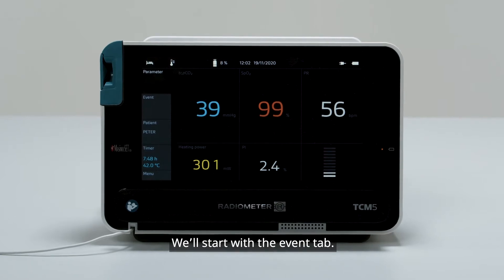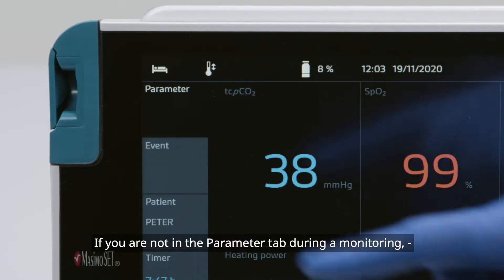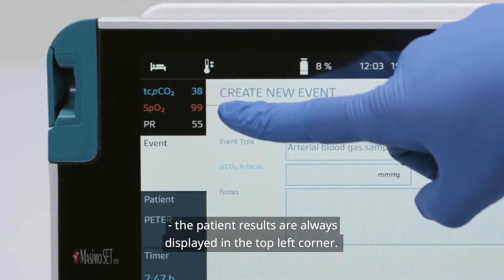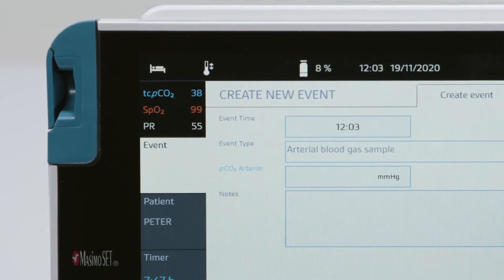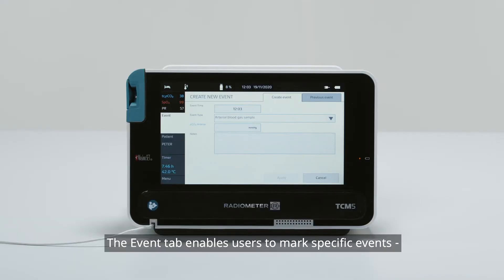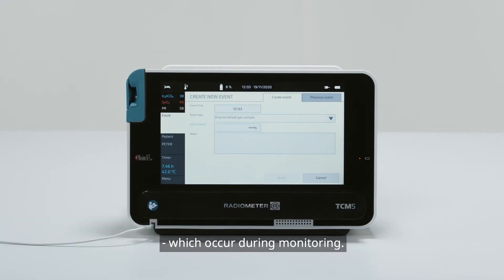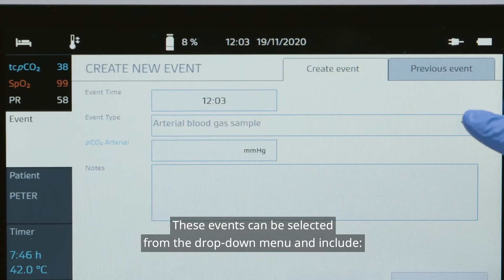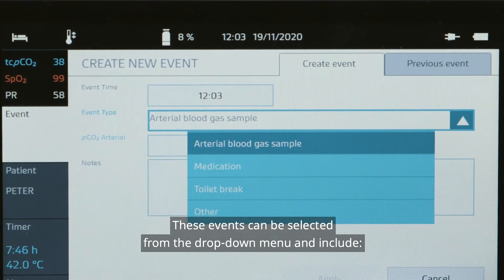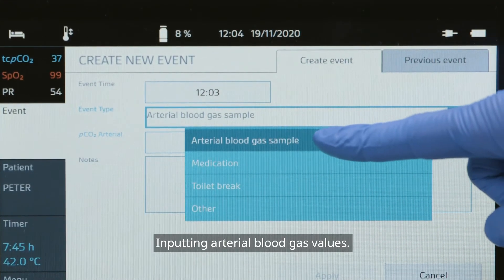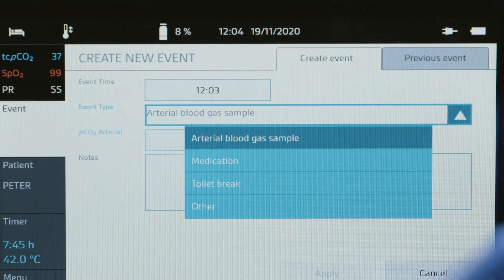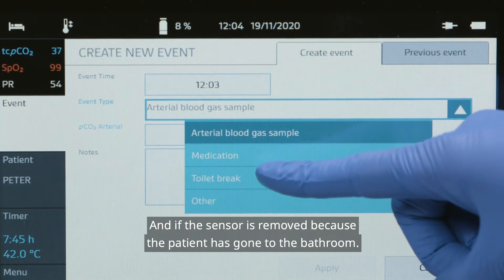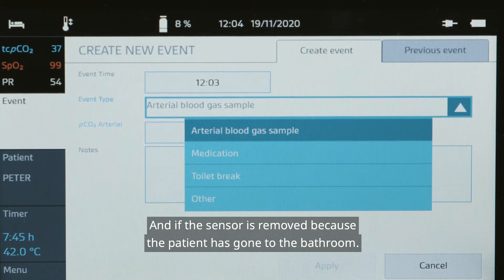We'll start with the Event tab. If you are not in the parameter tab during a monitoring, the patient results are always displayed in the top left corner. The Event tab enables users to mark specific events which occur during monitoring. You can only edit it during a monitoring session. These events can be selected from the drop-down menu and include inputting arterial blood gas values, any medication that is administered, and if the sensor is removed because the patient has gone to the bathroom.